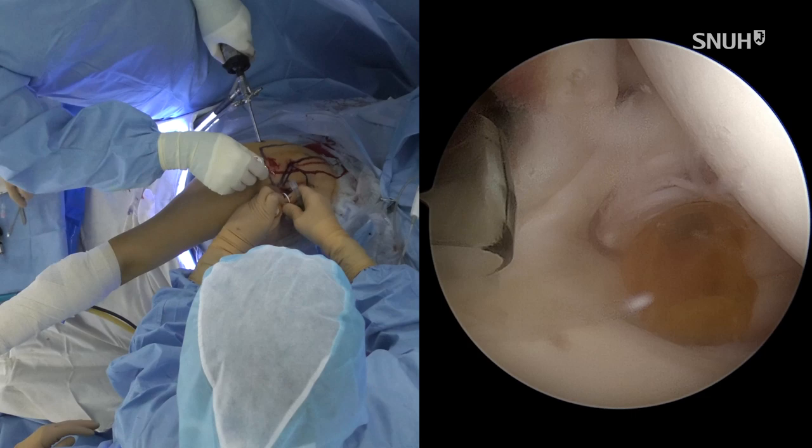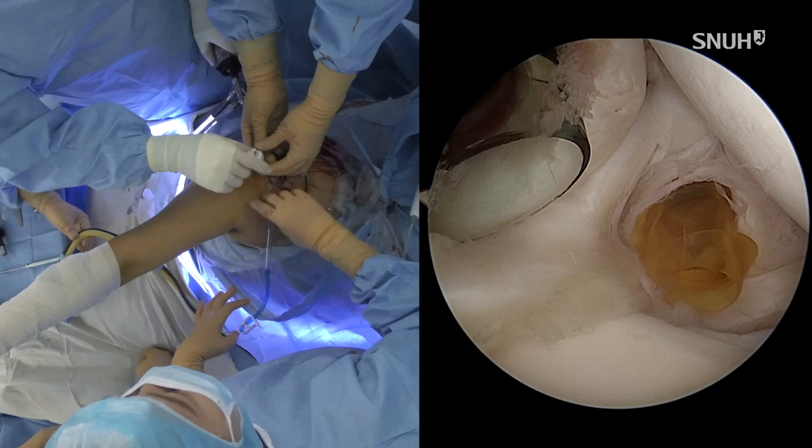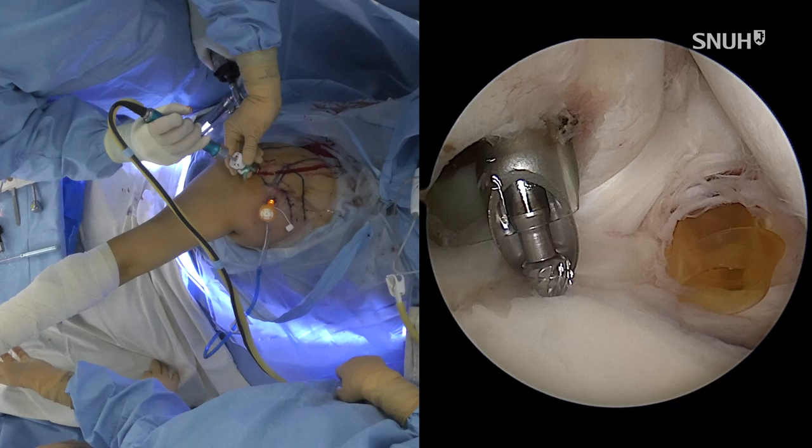So your assistant should hold this cannula well. So it's really direct to the superior labrum, okay? Or you can further decorticate the superior glenoid tubercle. Here, on.